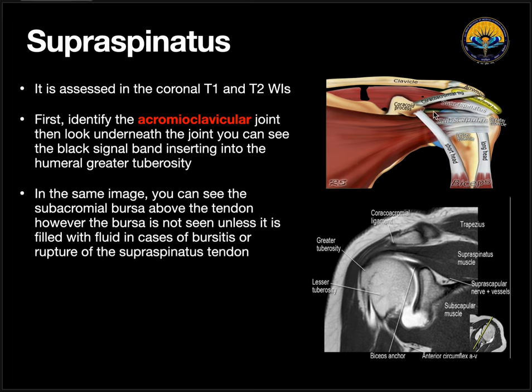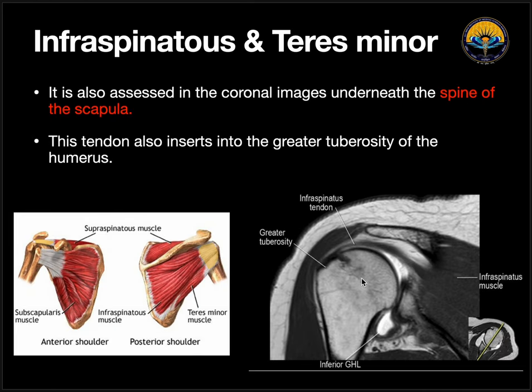Starting with the supraspinatus muscle — on coronal sections, we can see supraspinatus very beautifully. We have the acromioclavicular joint, and below it we can see supraspinatus going and inserting on the greater tuberosity. We can also see infraspinatus and teres minor on the coronal sections below the spine. However, to see infraspinatus more clearly, we prefer axial sections, as we can see the muscle, its tendon, and its insertion very beautifully on an axial section.